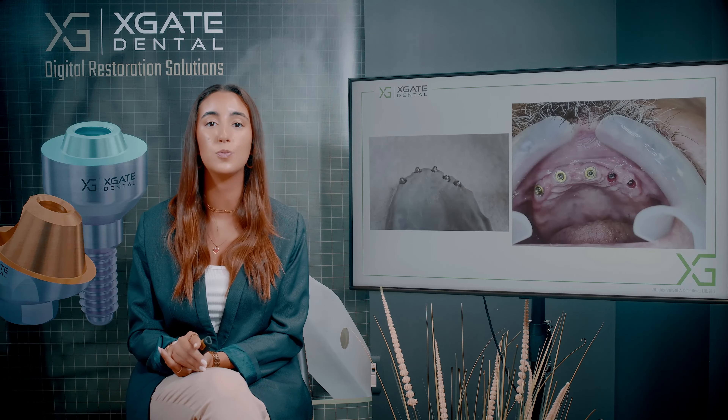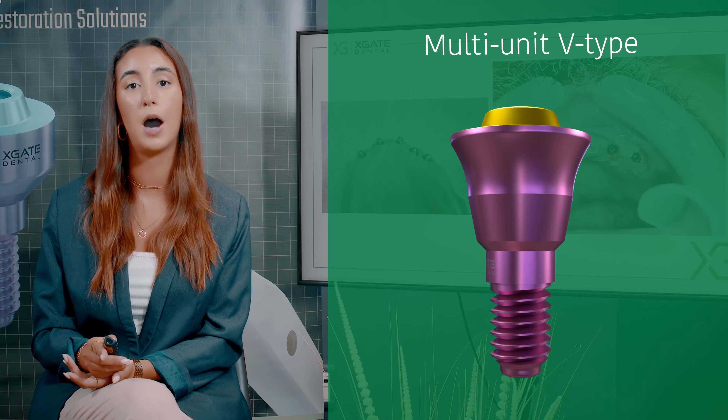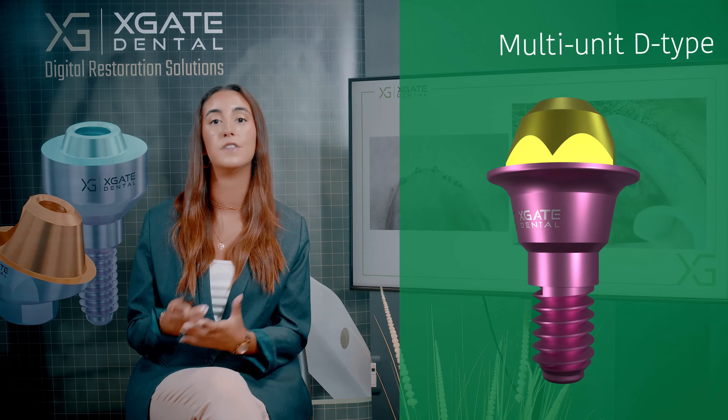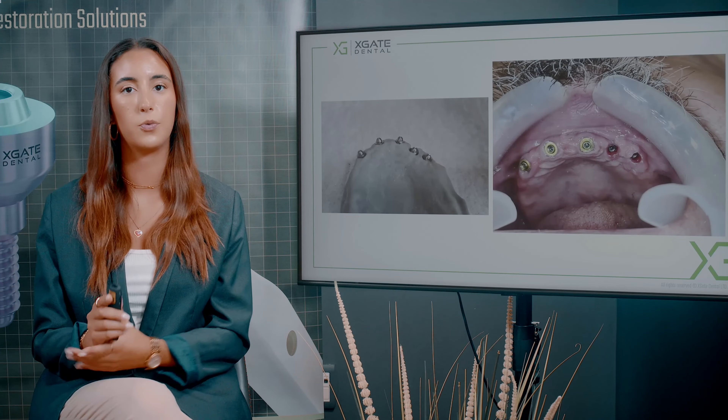You can see a demonstration comparing the two multi-units. The first one is in the mouth and the second one is on the model — the model of this patient. In the mouth you can see the small cone of the multi-unit, and on the model you can see the height of the cone that would have resulted from using regular ones.